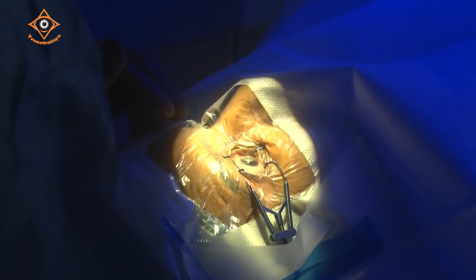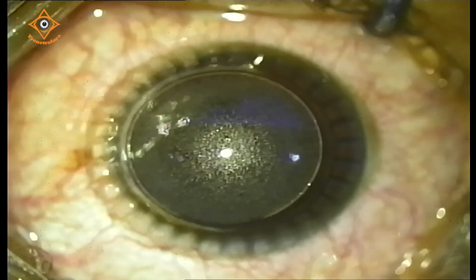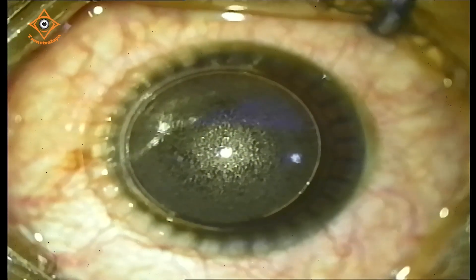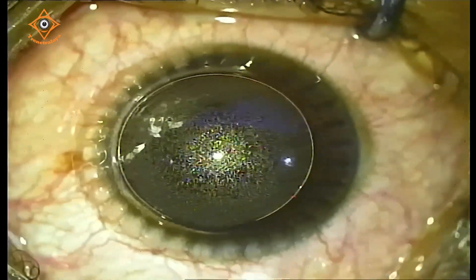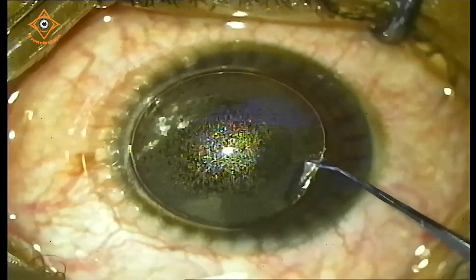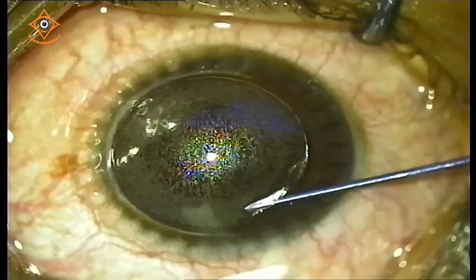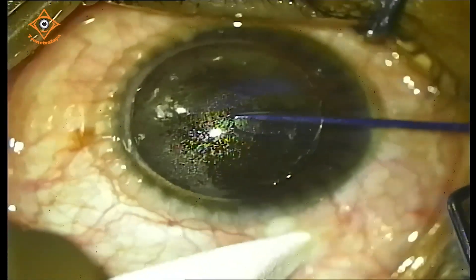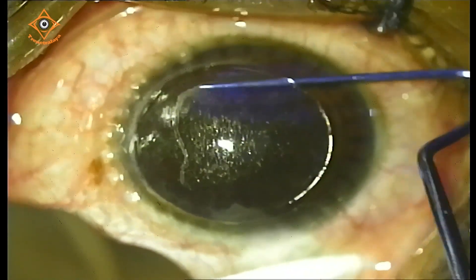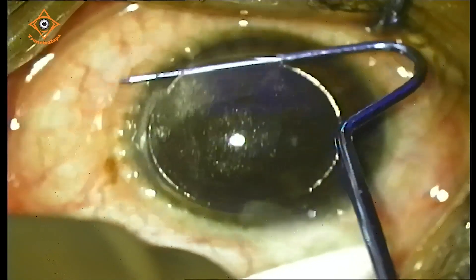We can now see a nicely centered flap. You can see how well the energy is optimized and how easily we are able to dissect. First pass — it has to be a very smooth dissection. Excellent — this is a very good dissection and there is hardly any resistance. The dissection is done.